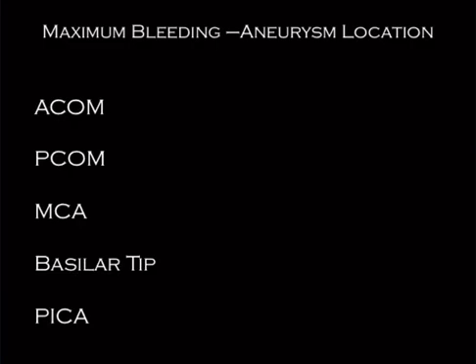You could argue this is useful for when you do eventually do the CTA, you can zero in on where to look, but there's a variety of reasons why it's not useful. One, aneurysms are often multiple, so you still have to look everywhere. So it's a little bit silly. But silly things lend themselves well to multiple choice, especially something like this, because it's a clear-cut situation where things are testable. So ACOM bleeds tend to be in between the interhemispheric fissure.